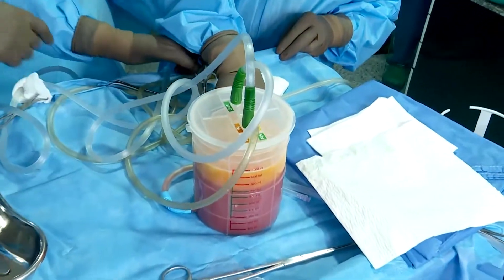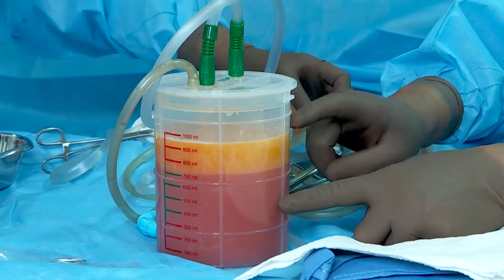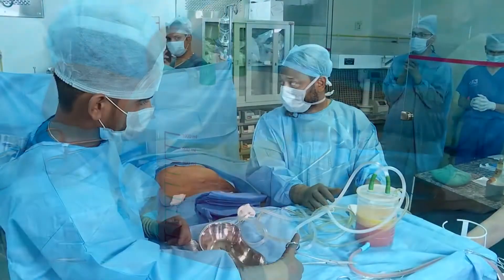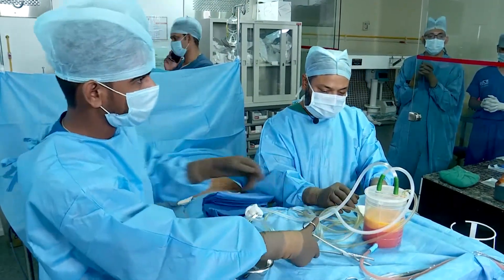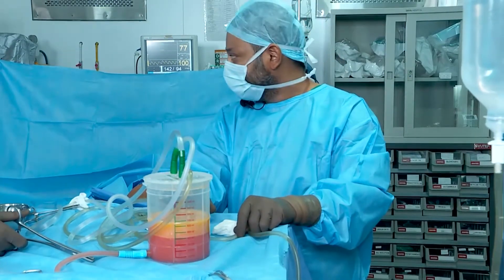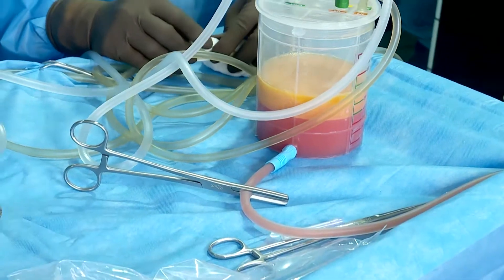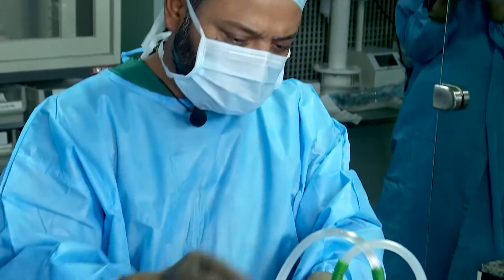We will discard this initial fluid and add more soda bicarb to wash and dilute the lipoaspirate. We have added more fluid to this — let it settle down. The amount of washing fluid is not a fixed criteria; it is just to wash, dilute, and discard the excess fluid.